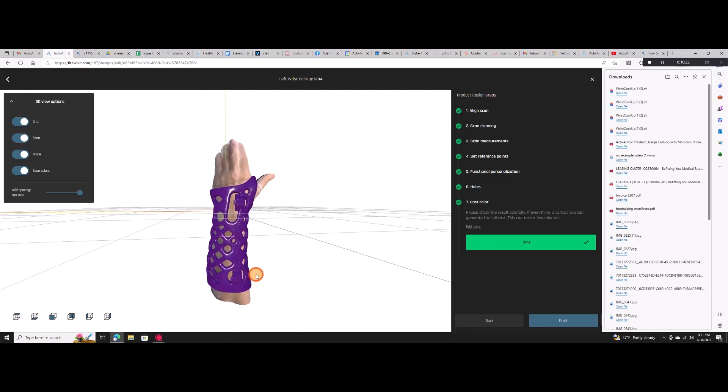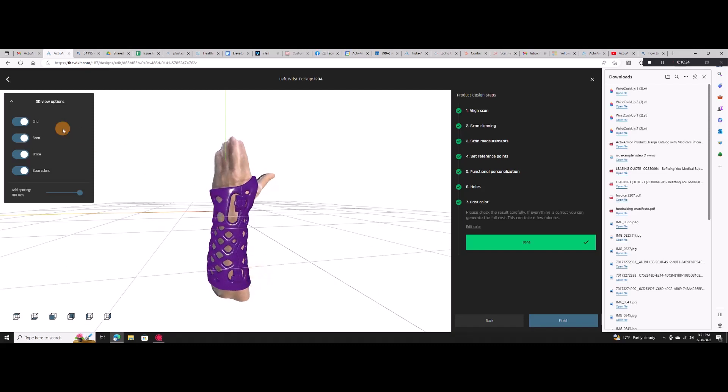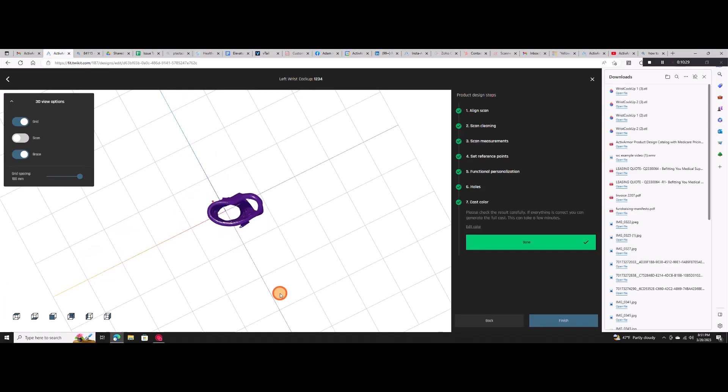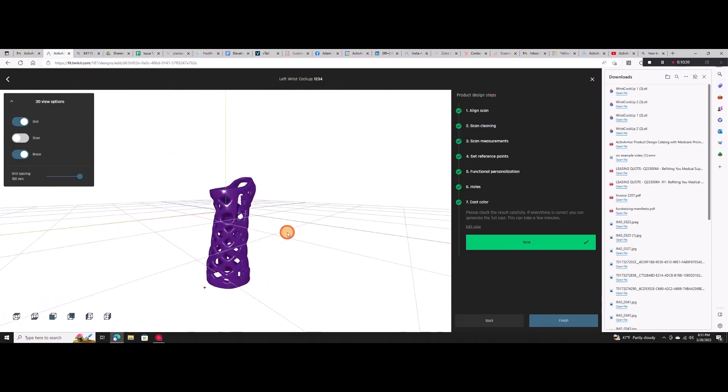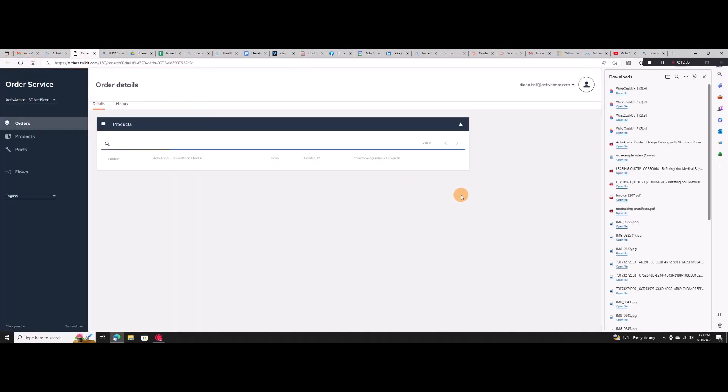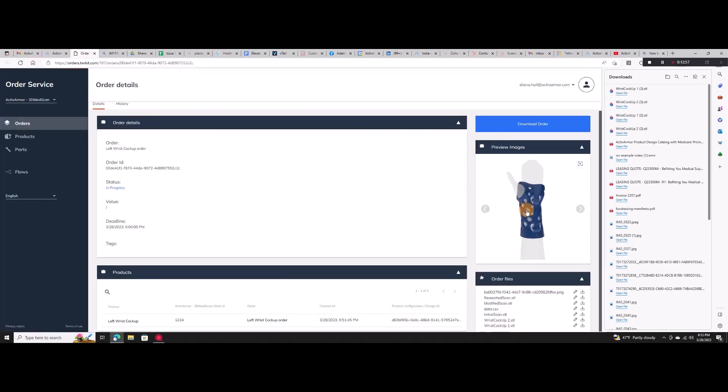Turn off the scan file to see just the cast. When you're happy with the design, select order. In a few minutes your custom cast is ready for download and print.